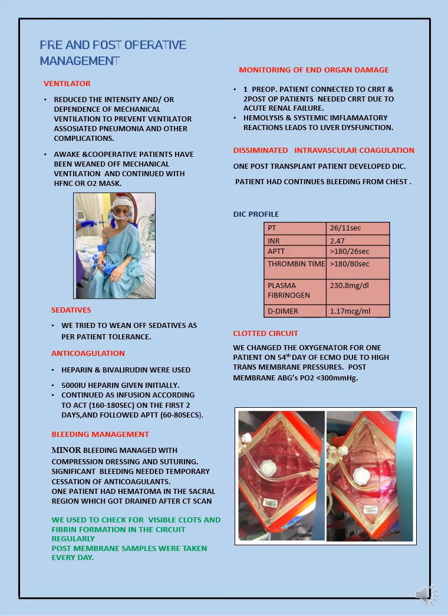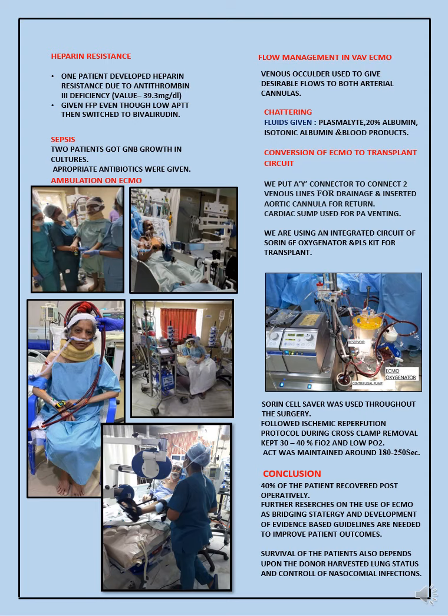We changed the oxygenator for 1 patient on the 54th day of ECMO. 1 patient got heparin resistance due to antithrombin 3 deficiency. Later, we switched to bivalirudin anticoagulation therapy for this patient. 2 patients had GNB growth in cultures and appropriate antibiotics were given.